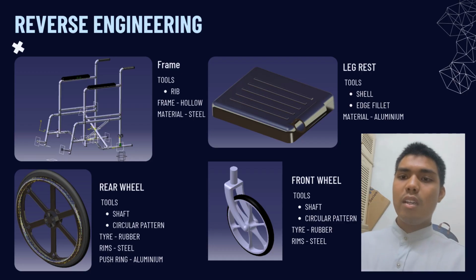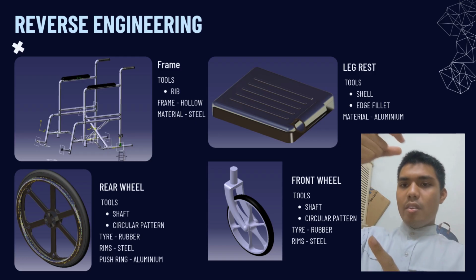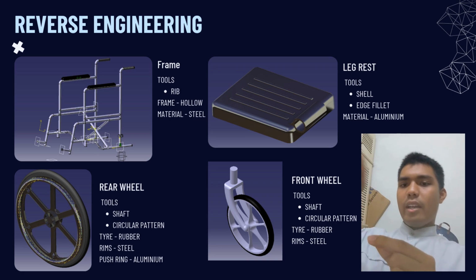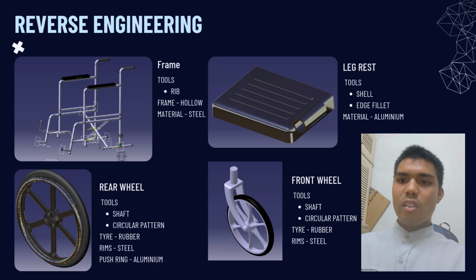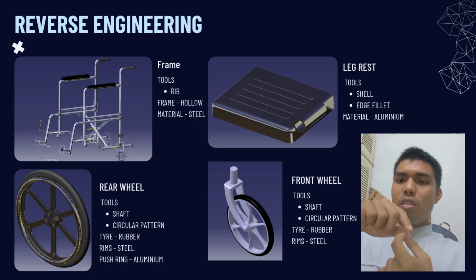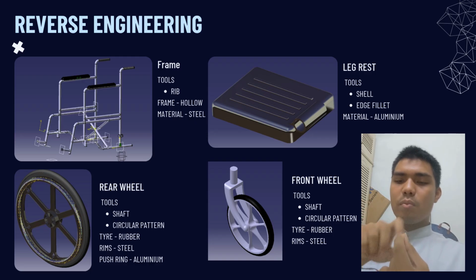For the modeling of the wheel, we use a tool called shaft to create a circular shape. We create it as one piece, and then we use the shaft tool on one axis, and we can get the tire from the rubber. For the rims, we use a circular pattern. We make one rim spoke that connects to the center, and then we use a circular pattern to get the other six to complete the product.